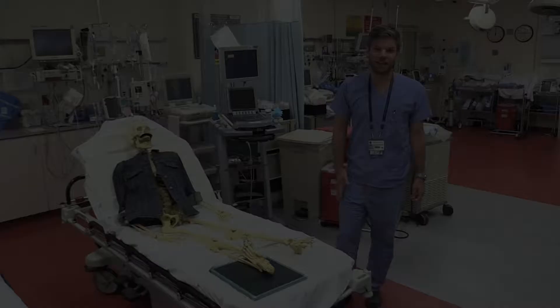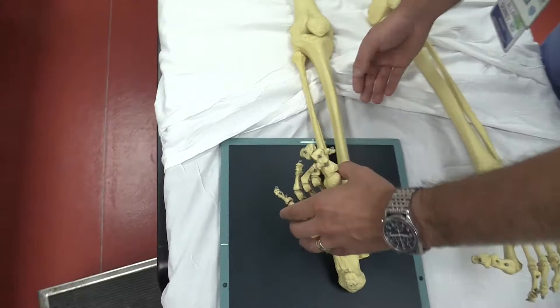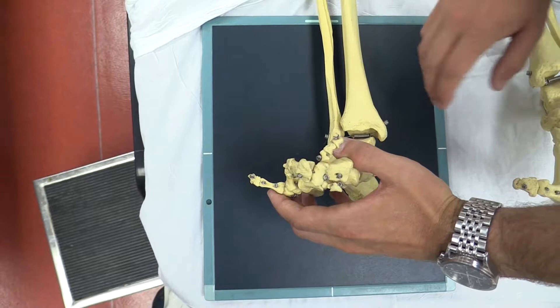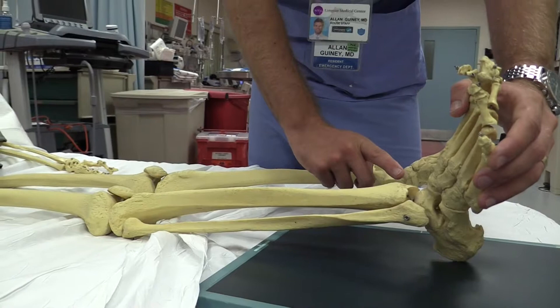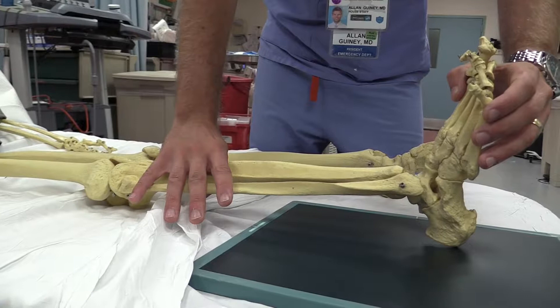Let's start with some anatomy. To obtain a stress view, you need to bring the mortise of the ankle joint perpendicular to your x-ray plate. In a normal ankle, you'll see that the lateral malleolus is actually a little bit posterior to the medial malleolus. The first thing you need to do is to internally rotate your patient's leg to bring those two malleoli into the same plane perpendicular with your x-ray plate.